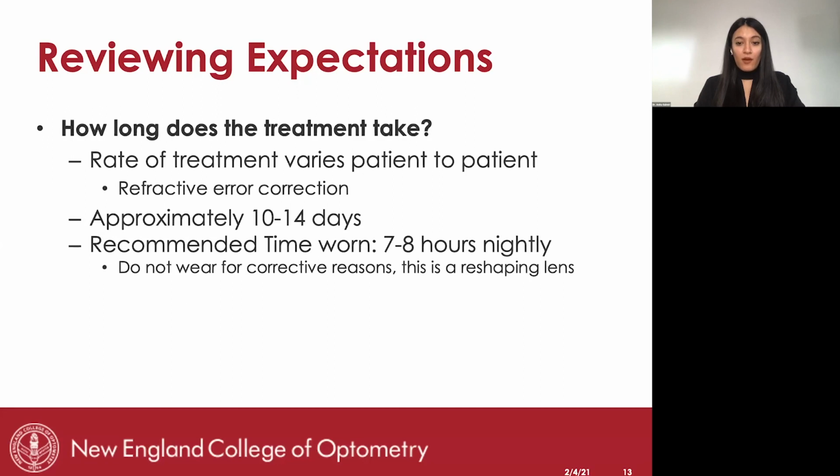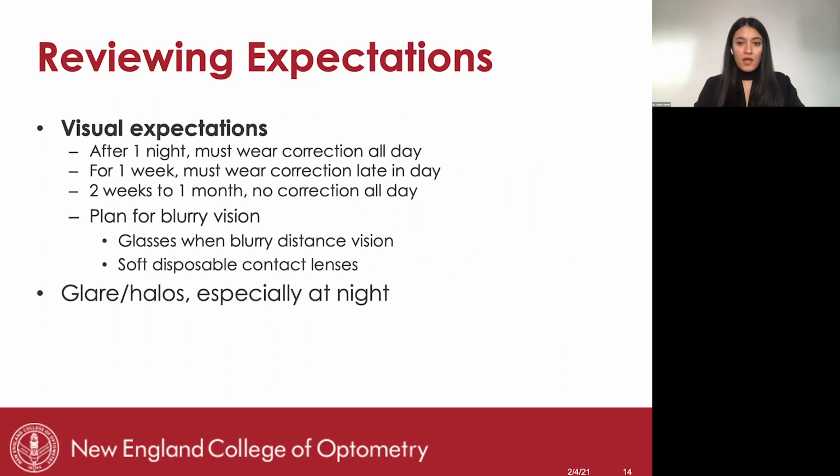One thing to note about wearing them during the day is that the treatment actually doesn't sit properly because of the movement and the lid interaction. And so it disrupts the actual centration of the treatment if the patient is wearing them during the day and the lens is moving around on the eye.